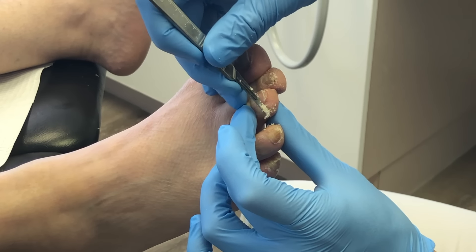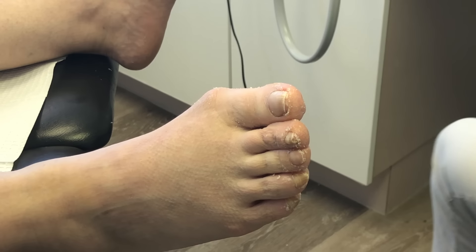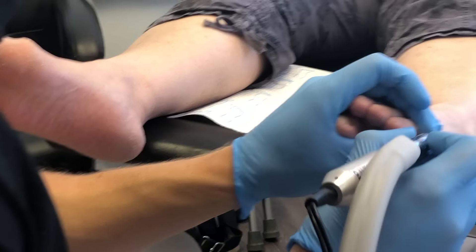This patient has rubbing between the third and fourth toes, which is why there's callus buildup there. I used the 15 blade again to reduce that tissue.